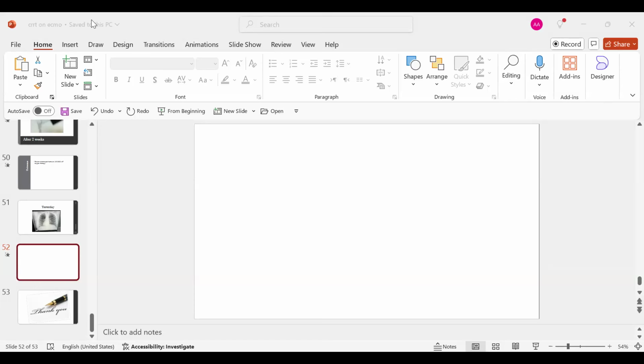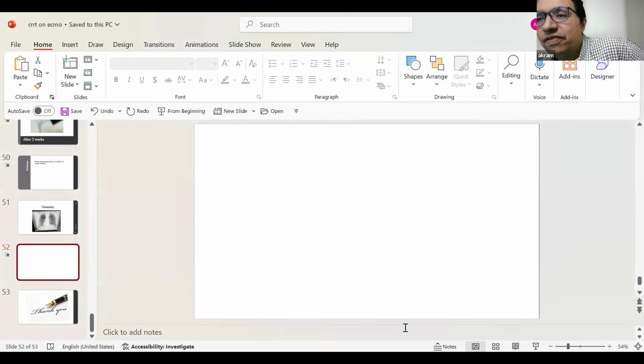For example, I have a question: how does incorporation of CRRT into the ECMO circuit affect your monitoring of oxygenation in the patient? Thank you very much, but it does not affect monitoring, because usually we monitor the patient himself, not the circuit, and the circuit is monitored automatically in some devices, not all devices. We monitor SpO2 saturation immediately before the oxygenator and after, so there is no interruption at this point.